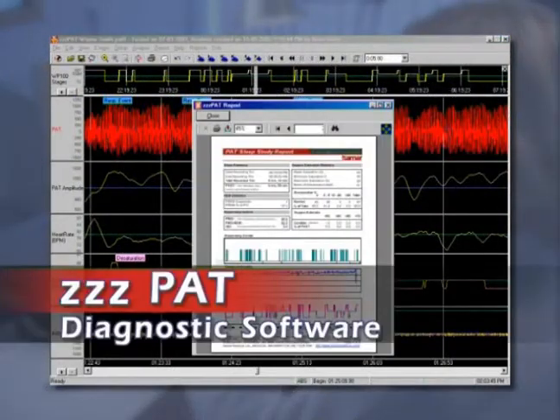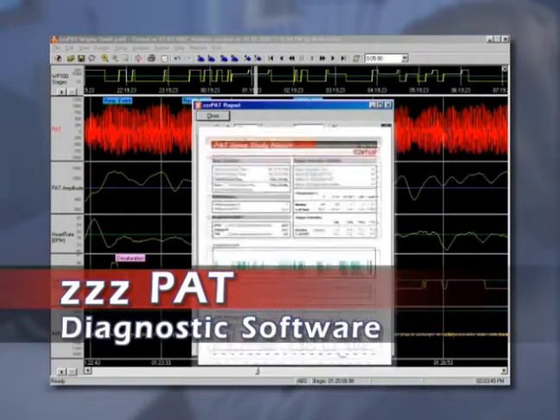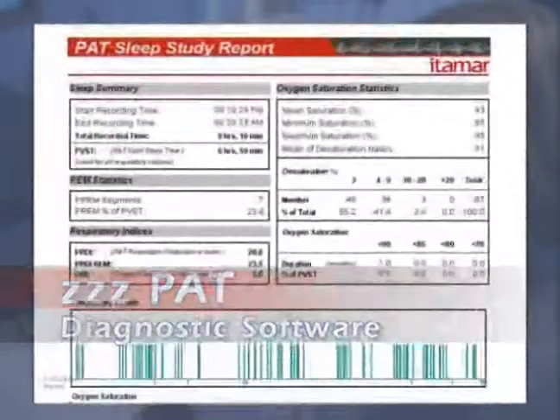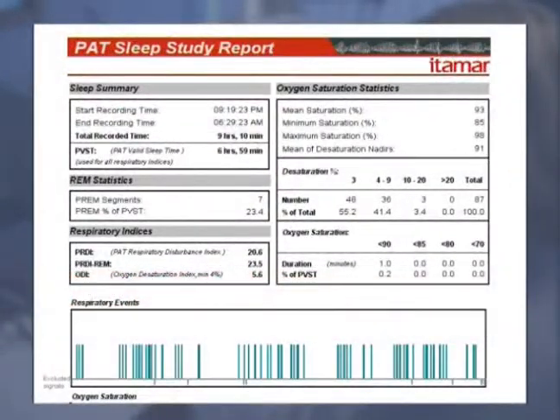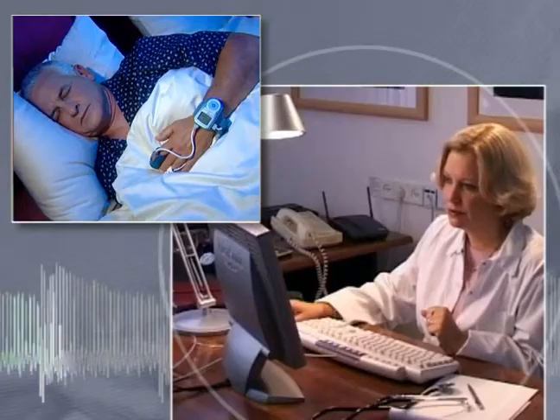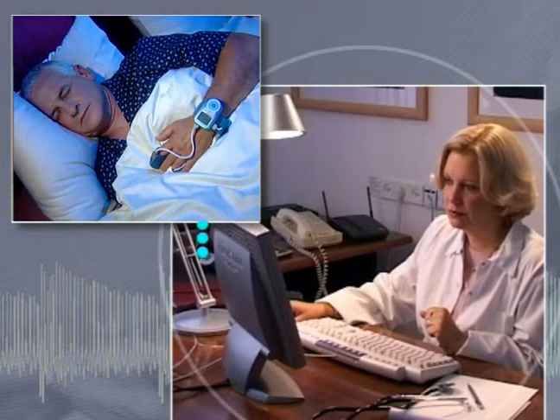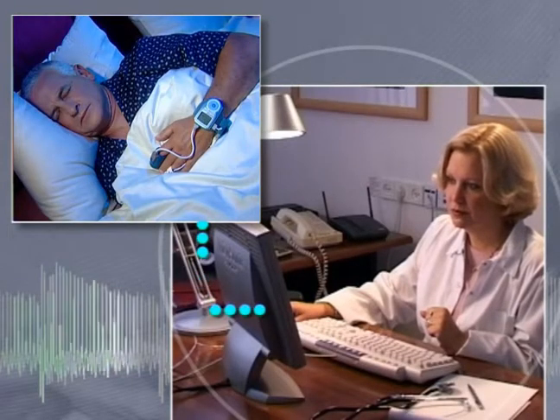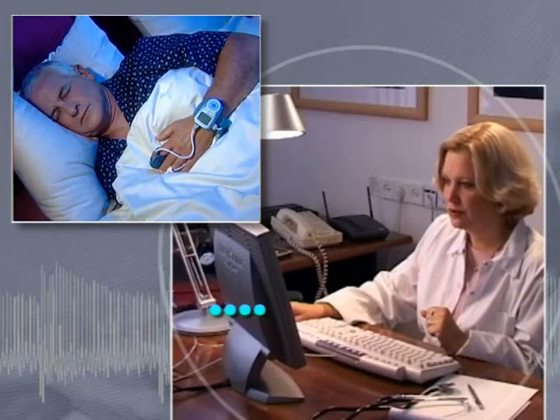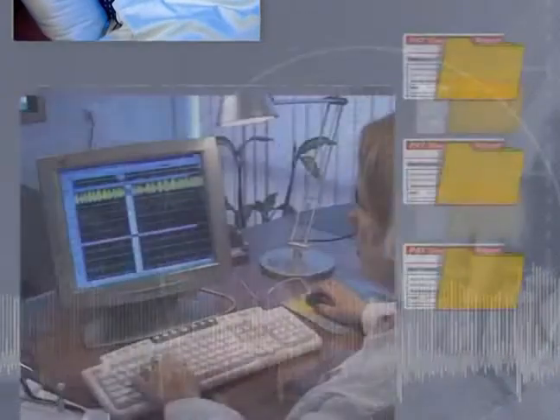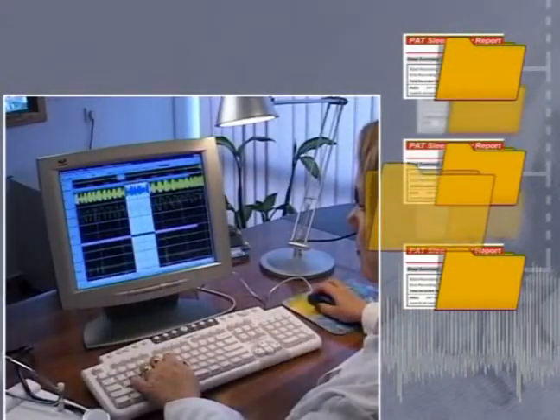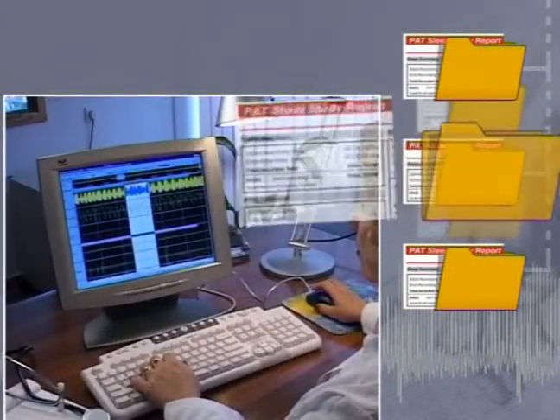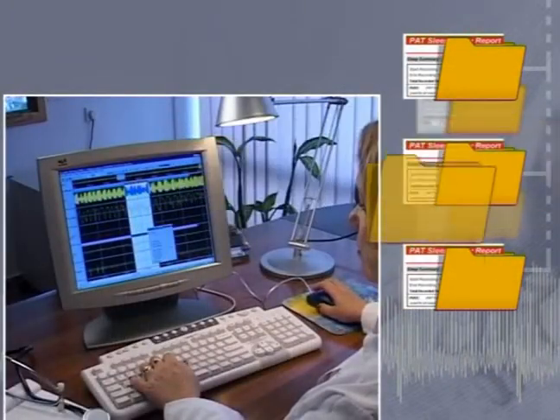While the software has been scientifically validated and FDA cleared to automatically analyze the channels, it is recommended that the sleep specialist personally review the channel traces and manually edit events according to their best clinical judgment.